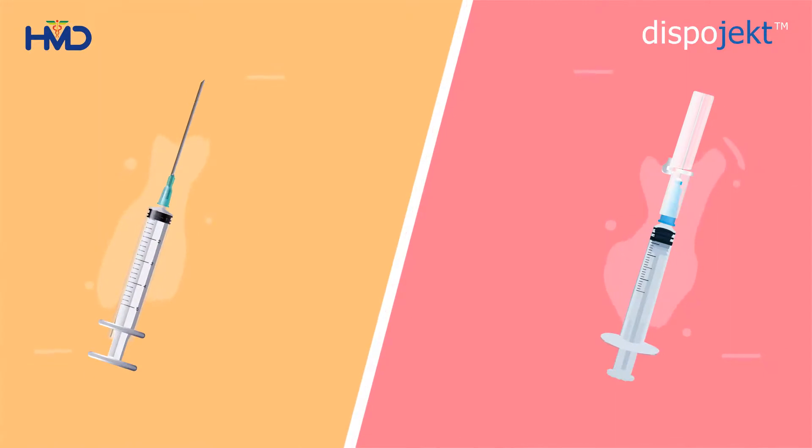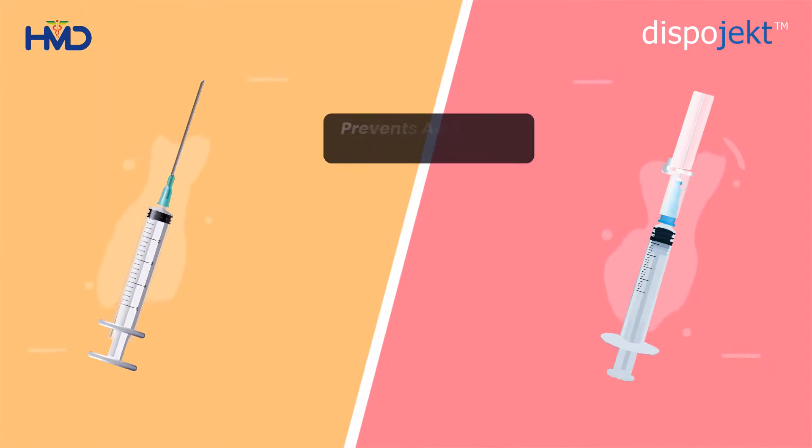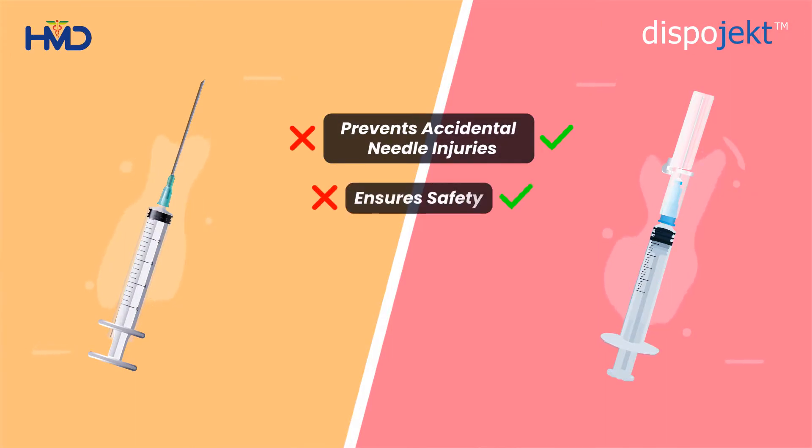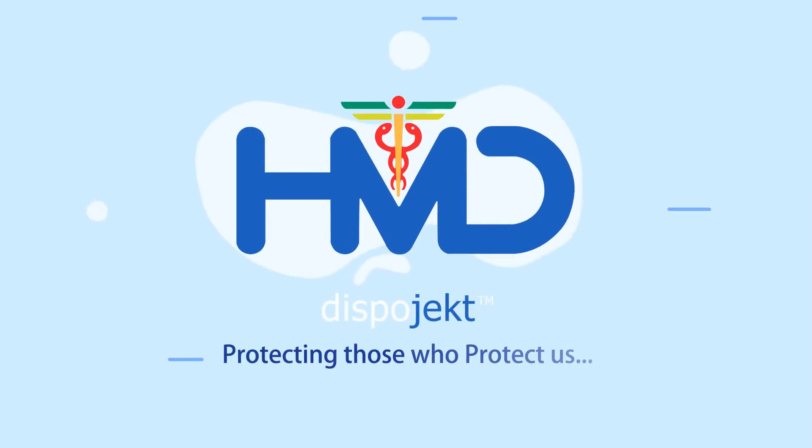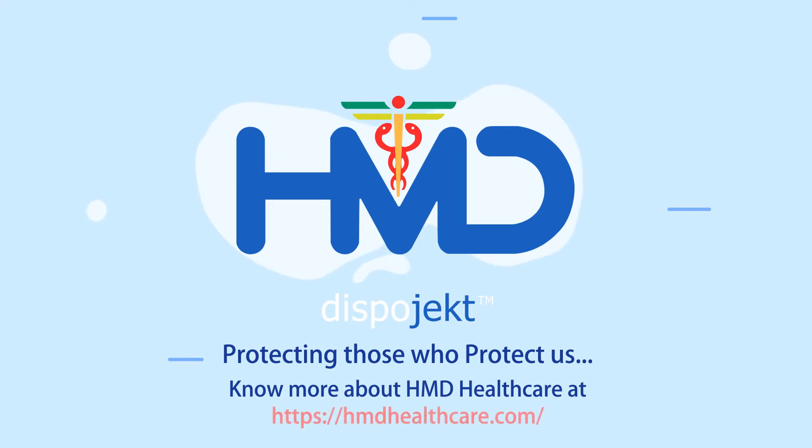Compared to traditional syringes, the Dispoject Safety Needle has a unique design that prevents accidental needle pricks and wounds, ensures the safety of healthcare professionals, prevents reuse, and prevents cross-contamination of blood-borne diseases like hepatitis and HIV. Dispoject — protecting those who protect us. To know more about HMD Healthcare, visit HMD Healthcare at HMDHealthcare.com.